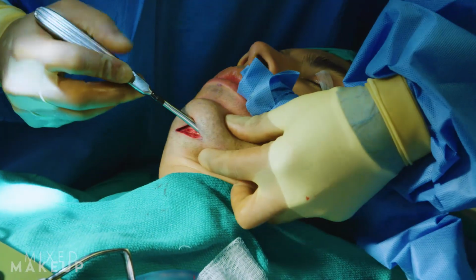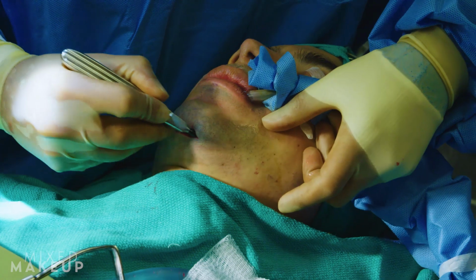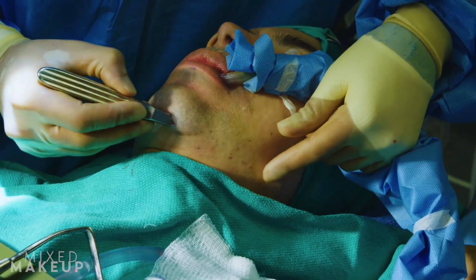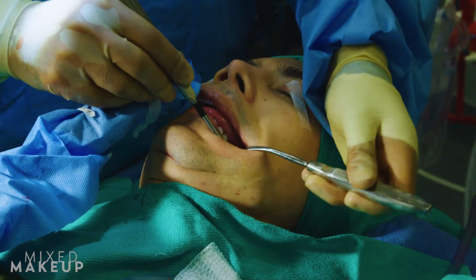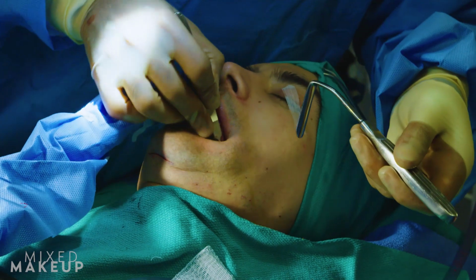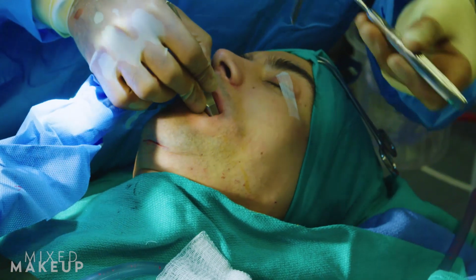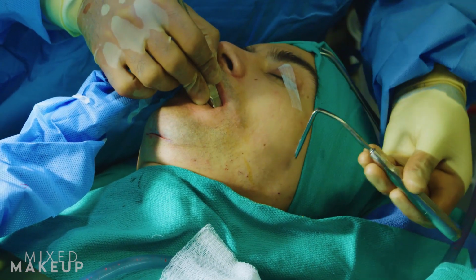There is a nerve right here. We protect it. I saw it. It's protected. And what we do is we just stay right on. You can see how it's a nice, beautiful plane. There's no bleeding. And I go to the corner of the jawline here. From inside the mouth, it's going to be difficult to see, so I'll just show you again with my instrument, down to bone, and I've connected now from the chin side. Now I'm down to bone here, and now I'm able to pass the implant through because I have access to the complete jaw.